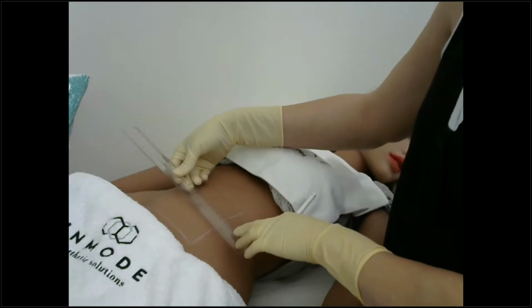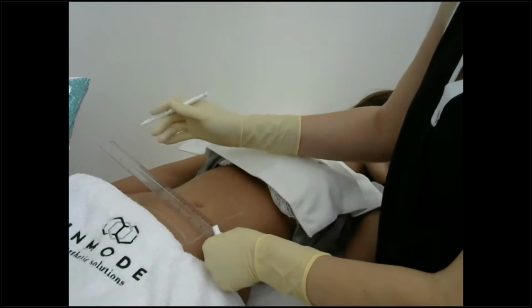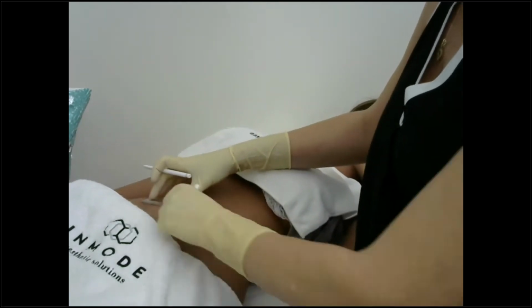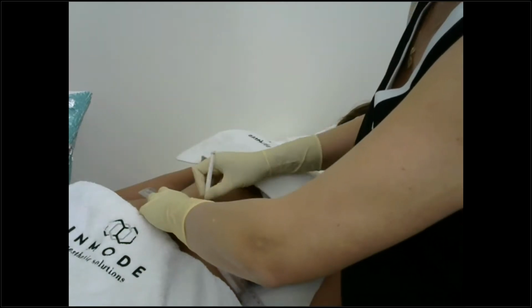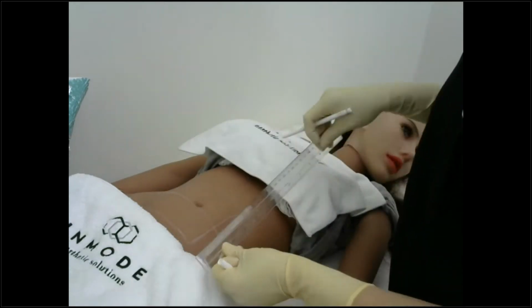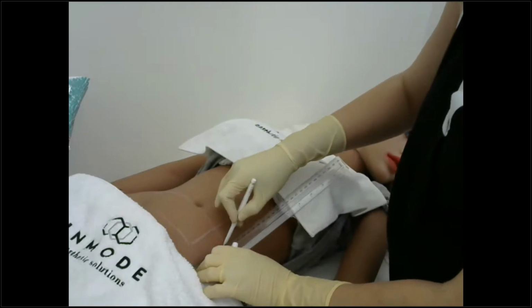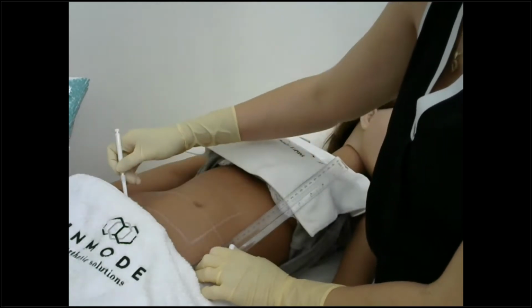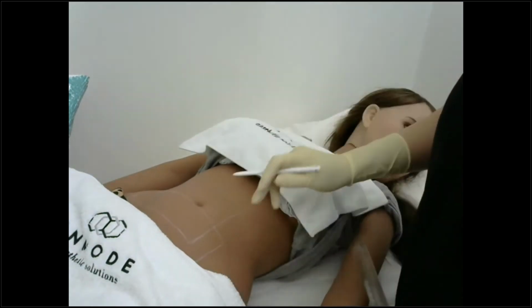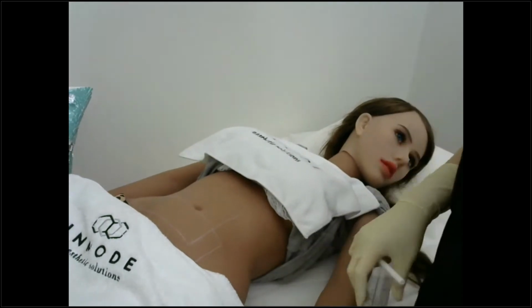Slightly smaller, but I just like to work on a straight line. Okay, so I kind of take this area. So we have 3 multiplied by 6 is 18. 6 times the chamber, and then 7 centimeters. For a smaller patient, and again, it doesn't have to be 100% accurate. I just want to make sure that I'm not working on an area that is too large. Okay, so this would be the area. This is 6 times the chamber size.